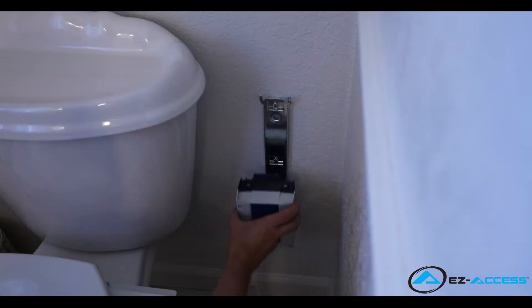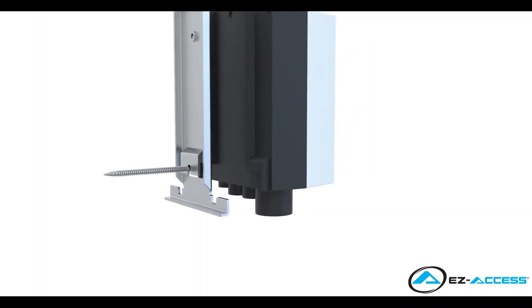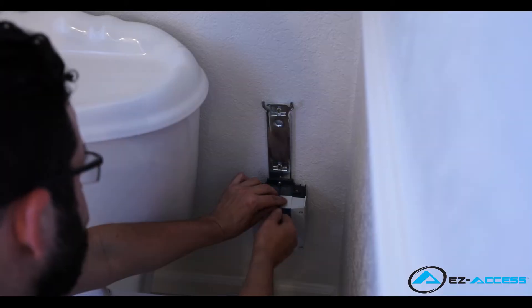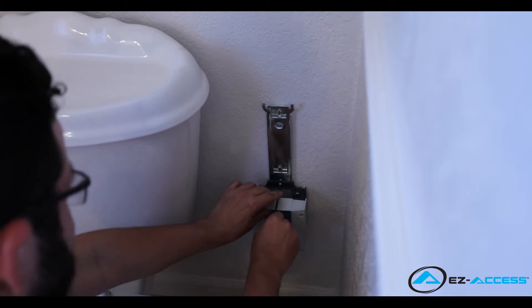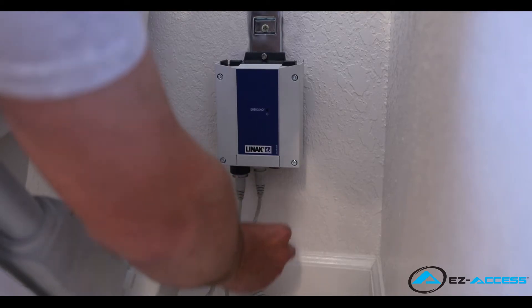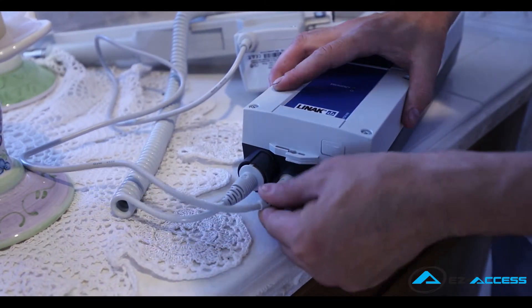Once the mounting bracket is securely in place, slide the control box onto the mounting bracket ensuring that the slots on the back of the control box slide into the tabs on the mounting bracket. To secure the control box in place, tighten the single screw using a 3mm hex key. To provide power to the tilt, connect the actuator to the control box by inserting the jack into the hole next to the plug for the handheld control.